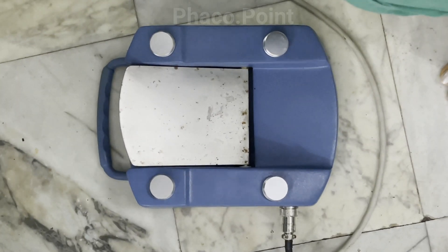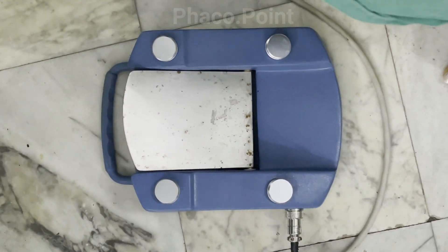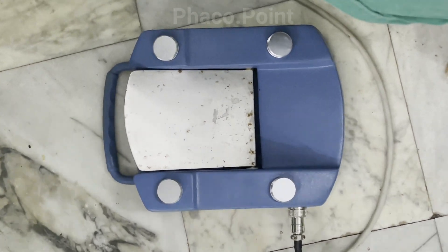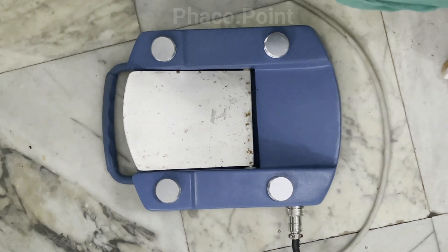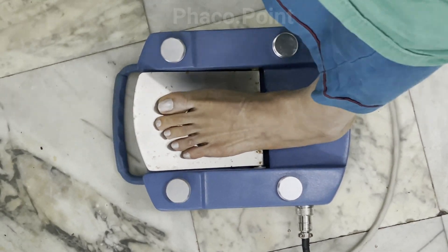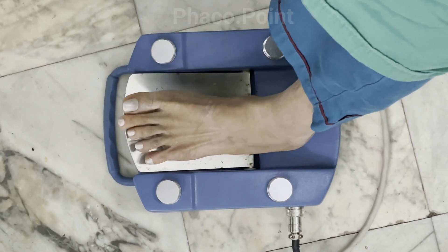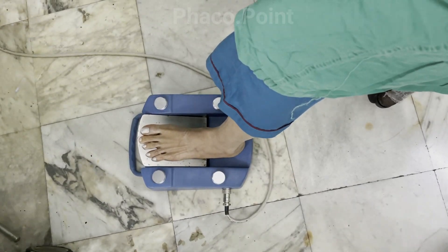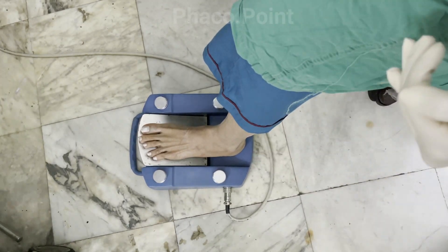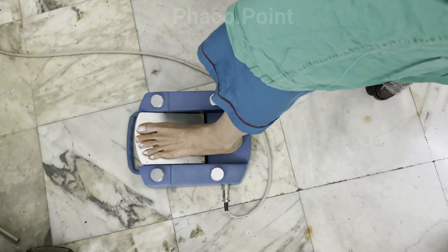It is extremely important for all novice FACO surgeons to become thoroughly familiar with the foot pedal before they ever hold the handpiece and start sculpting in their first case. Not only should they know how far in or out the foot pedal needs to be placed, but also the correct angle of the knee — which should be more than 90 degrees — to allow for smooth dorsiflexion and plantarflexion movement of the foot.